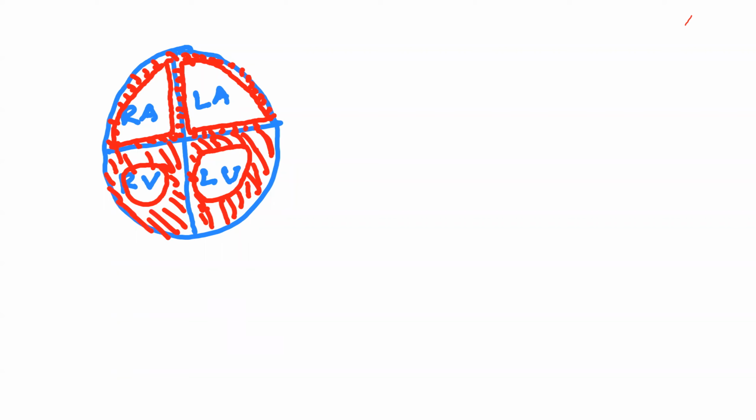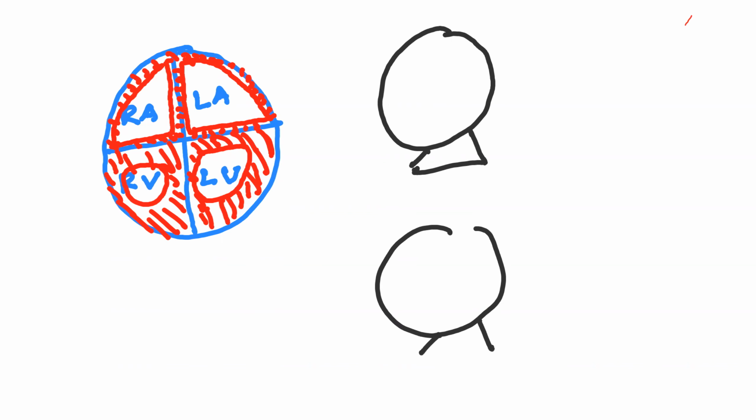If I measure the electric activities of the atrium using the galvanometer, don't mind whether it's negative or positive. It depends on the way of the electric activity and the exposed electrode.